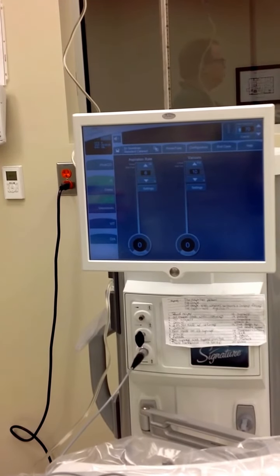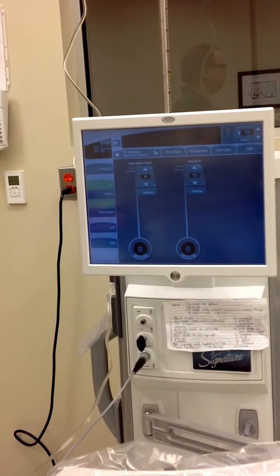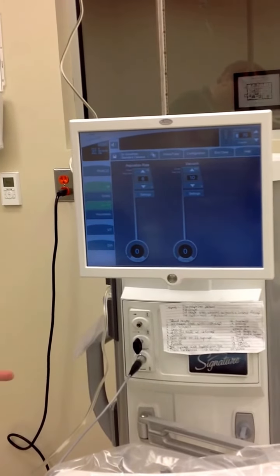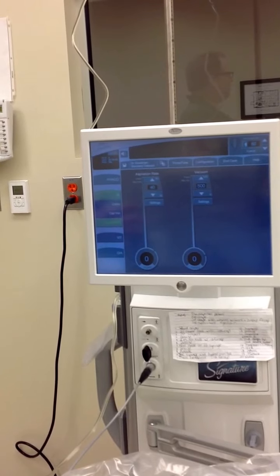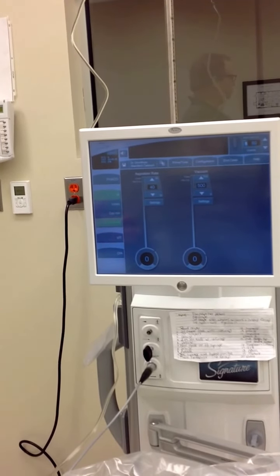My recollection is that Dr. Goodman does not use the machine for this stage of the procedure, but in case he does, it's available to him. And the viscoelastic mode is for removing the viscoelastic after the IOL has been implanted.